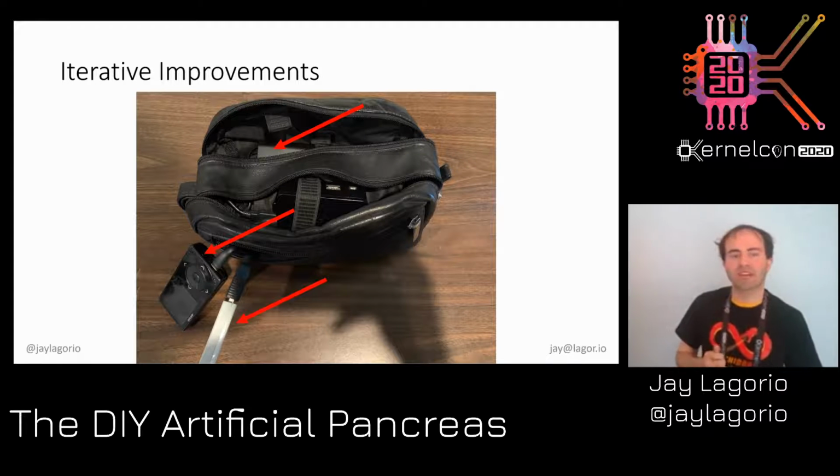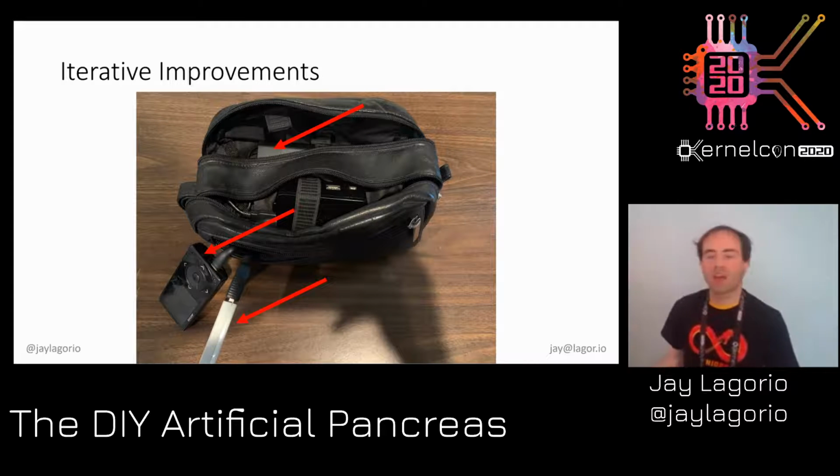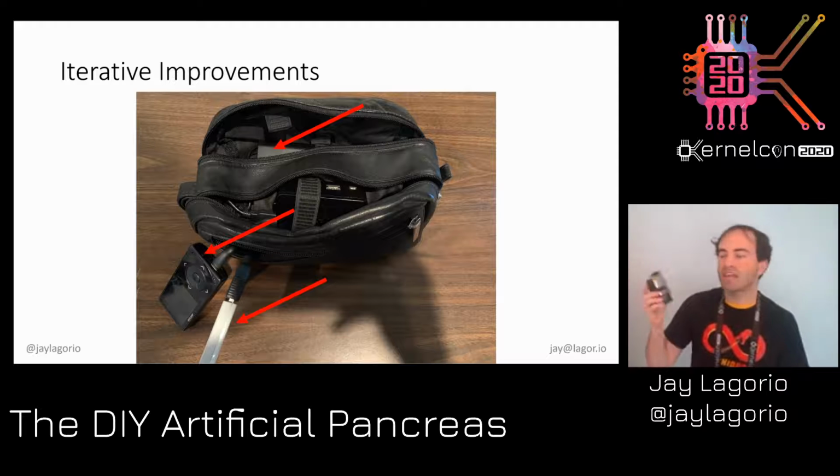And this is a little radio stick. Medtronic has a web service that I swear to God operates with Java and JNI to shovel bits from your insulin pump through this little USB radio stick up to their cloud so that you can do some analytics. And this thing, I don't know whether to attribute it to malice or incompetence, but like a foot or two away, and this thing stops communicating with the insulin pump. This thing works like 10 feet away.